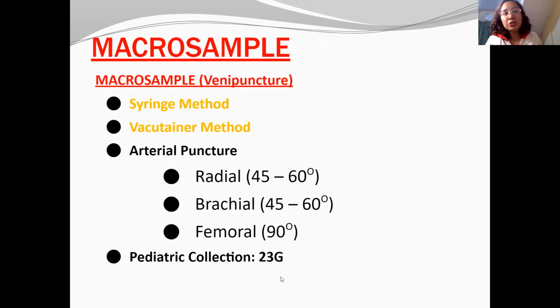Yan, so arterial puncture, so usually the purpose of arterial puncture is for arterial blood gas. Yan, so ang gumagawa nito guys are respiratory therapists. And yun, when I was working in the hospital, there was no respiratory therapist, and the medtechs were the one performing arterial puncture. We were the one processing the arterial blood gas.